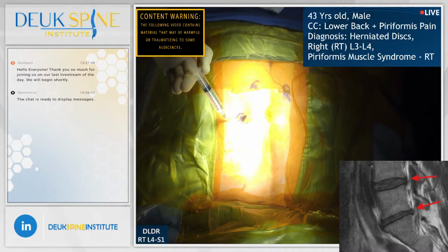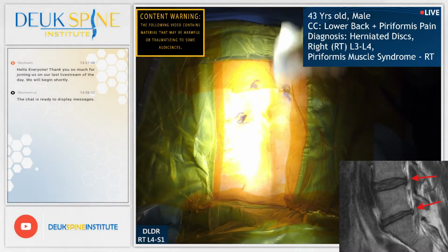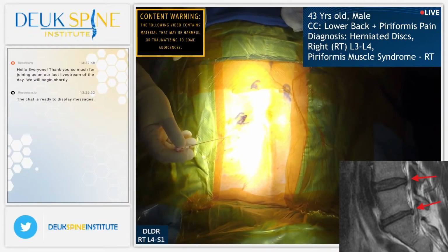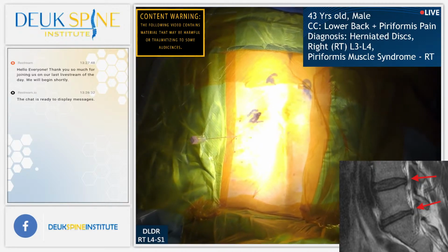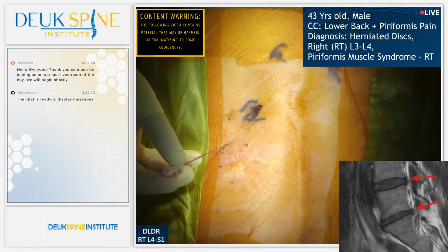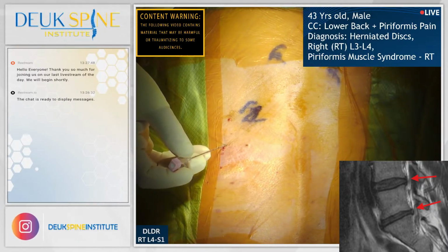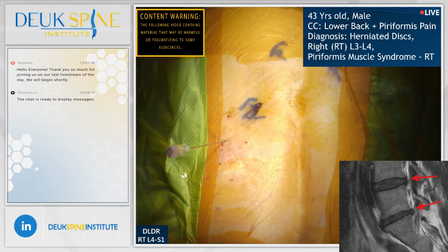Our patient is under propofol sedation, meaning that he is getting IV sedation, but he's sleeping. We want him comfortable sleeping while I place the needle. I'm going to place 1 needle at L5S1 and 1 needle at L4-5. Once I've placed these needles, I'm going to gain access to the damaged discs, specifically L5S1 and L4-5, and then repair these 2 discs with the Duke laser disc repair.